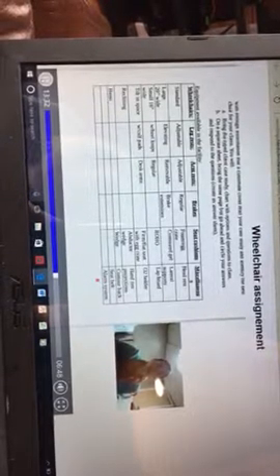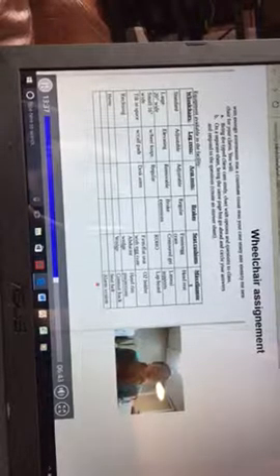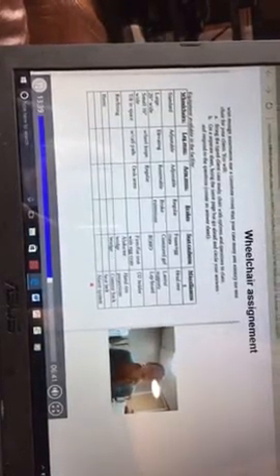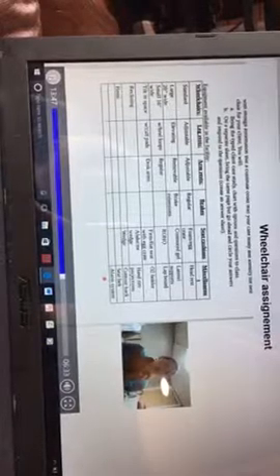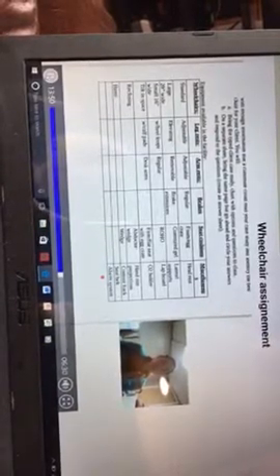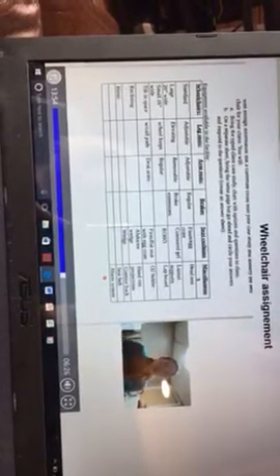And then an alarm system. A seat alarm would go underneath the client. As they go to stand, you would either hear an alarm sound, bells chime, or sometimes even loved ones can record a message, like, Dad, you need to sit down, or call for a nurse, use your call light, depending on what type they have. So that's the kind of alarm system they're referring to in this also.